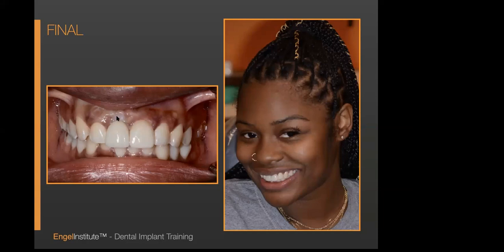This tissue right here is just because we opened it up that day to seat the crown. But I've seen her since. This is quite a while ago, and this all looks really nice. And we did okay. Not bad.